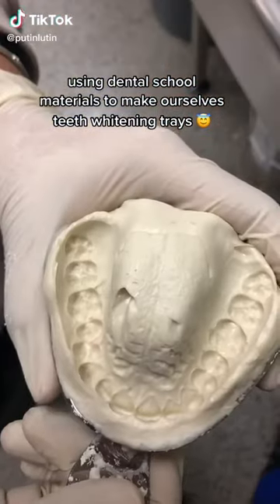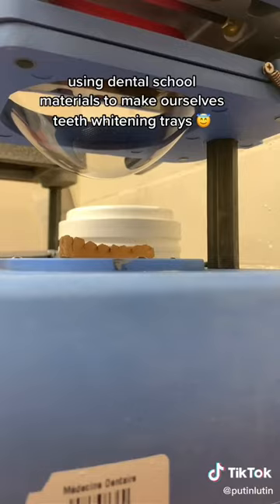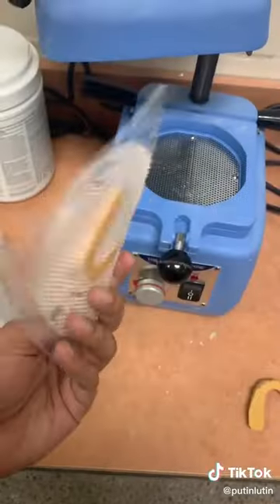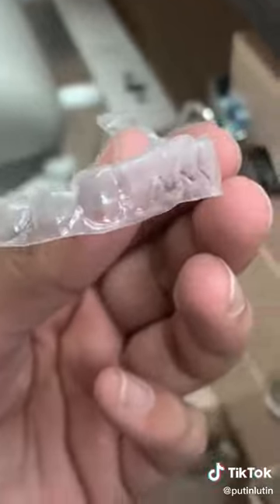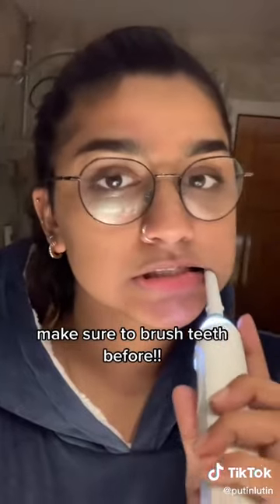Using dental school materials to make ourselves teeth whitening trays. Make sure to brush your teeth before starting.